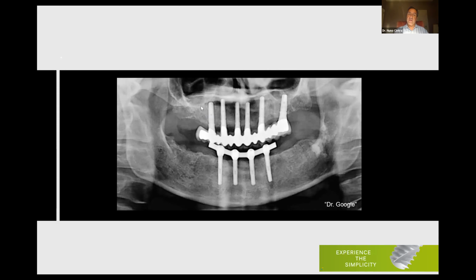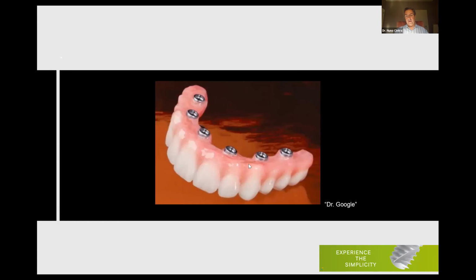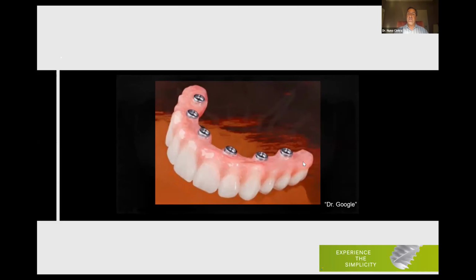This implant should come out there. No cantilever. And in this case, there was no need for this. No cantilever, or at least 1 tooth in cantilever. You see the prosthesis, very nice provisional or final, I don't know. But 6 implants, the final one coming out on the 5. No, this one should come out there, even in a case with bone available.